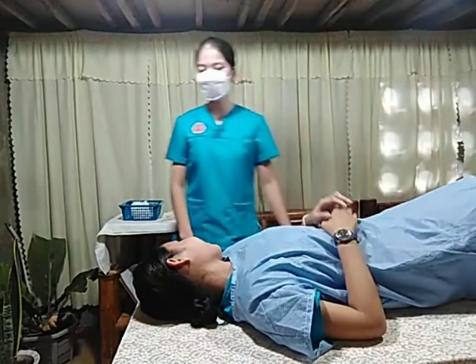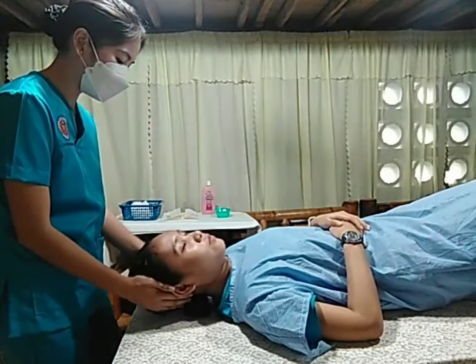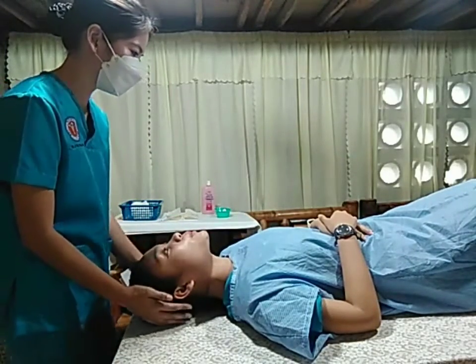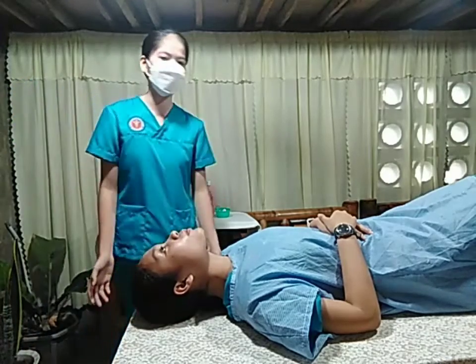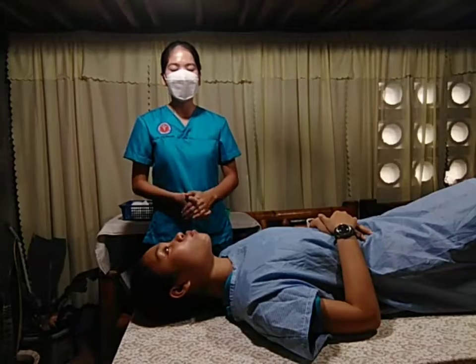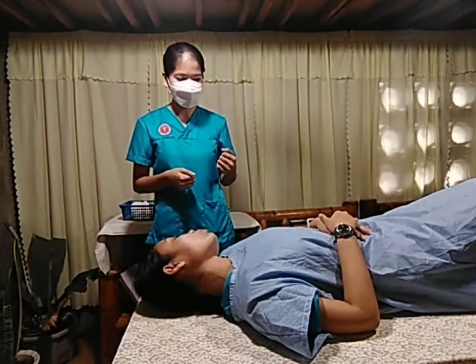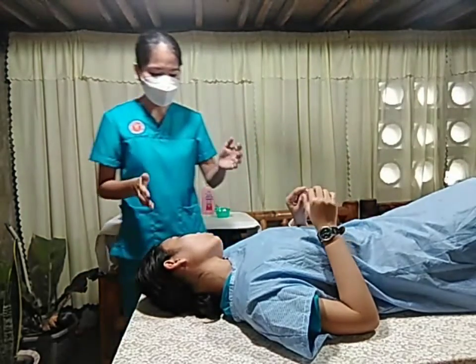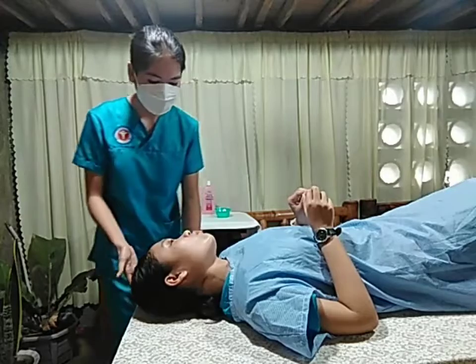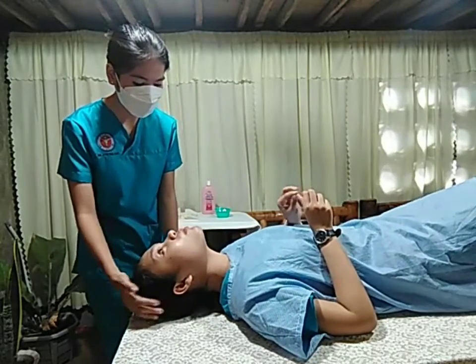Okay. The next to it is we're going to position the head properly. So, okay. For the first axis, we have the axis of posterior pharynx. So, we have to tilt the head backward. Okay.